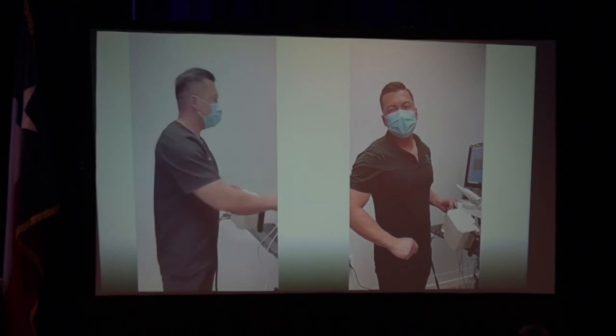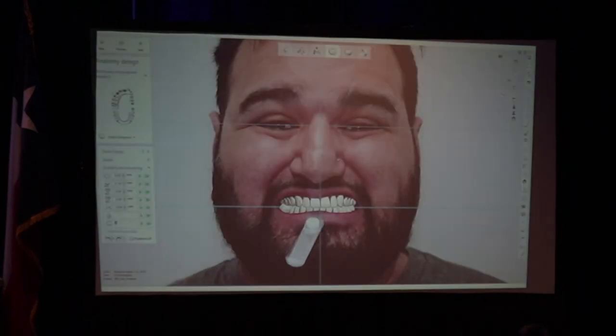Okay, guys, I'm gonna set this up. How'd I go so far back? So you open up the bite. This is after his ortho. Open up the bite. What am I doing? Smile design process. I need to take the photo of where it's opened up, and then I need to take the scan of where it's opened up. It's pretty much all the same. Once you start doing analog, you can do it in digital. Honestly, I started in the digital process, so I didn't even do all these things analog. This is it. This is simple.